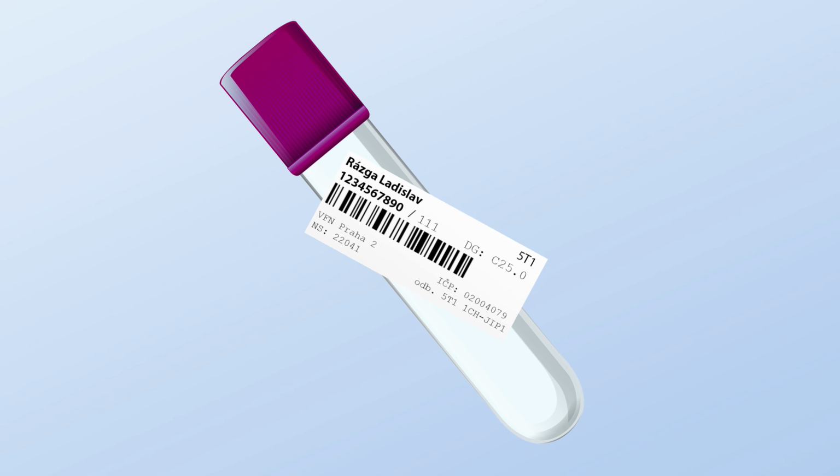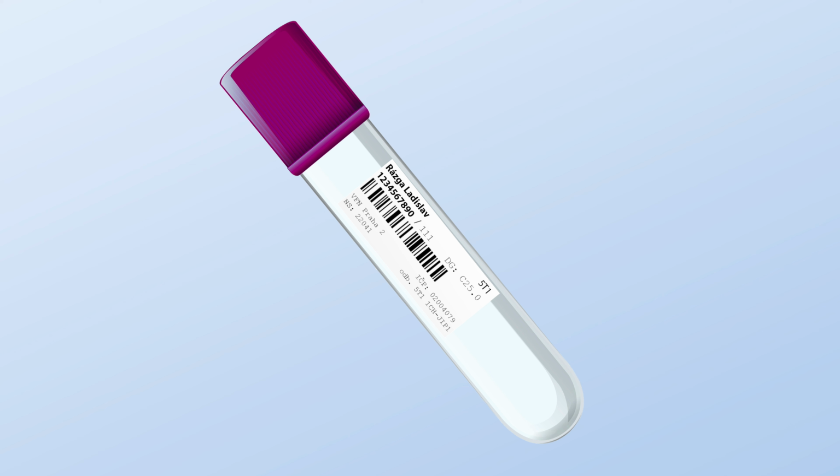A blood sample for immunohematological testing is collected by venipuncture into a pre-labeled test tube, which must be filled with at least 6 milliliters of blood. Only if vein access is not possible may blood be drawn from a catheter or cannula, but only at least 1 hour after the last medication or infusion, and the first tube is discarded and not sent to the lab.